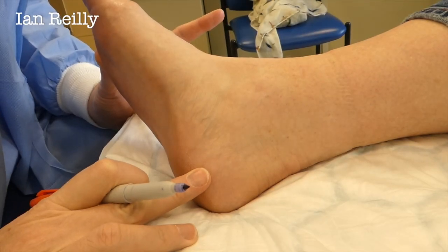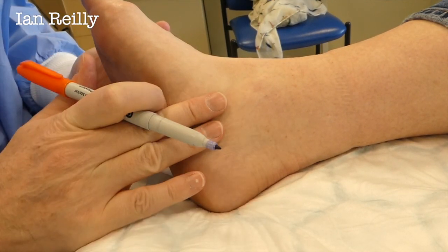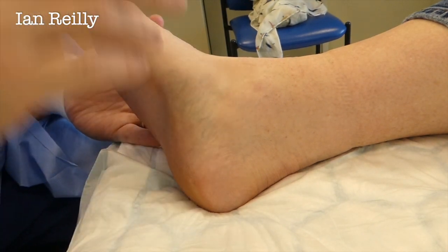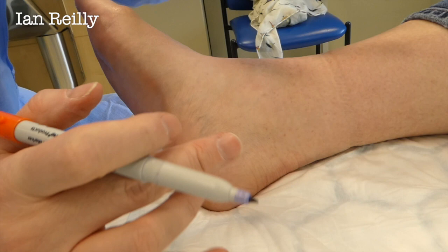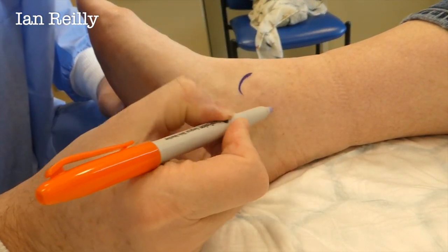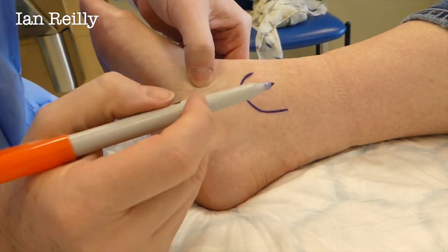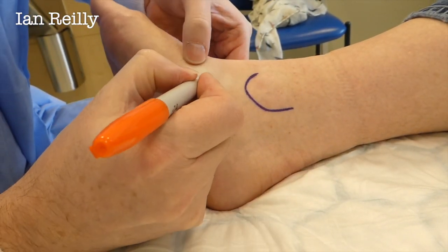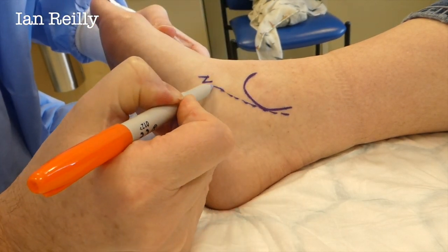So Rita, you've come back for injection number two. The first injection was on the outside, but now you're left with some pain on the inside. I just want to mark up some anatomy. Here's the edge of your ankle bone there, and here's your navicular bone — so we've got one tendon coming around there.